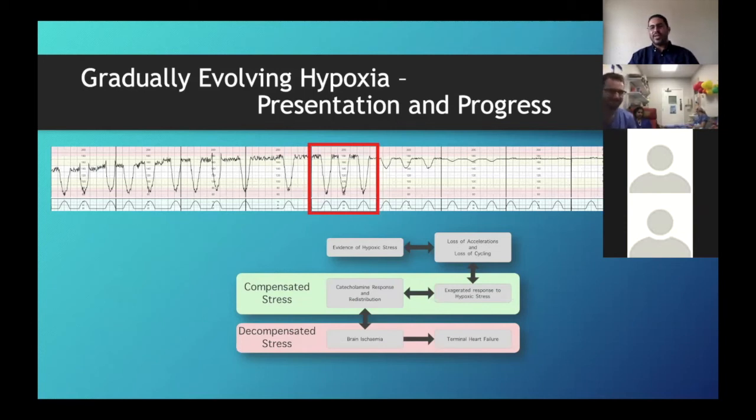You're trying to make STAN not alarm. You don't want to reach the point that STAN is alarming. I think we should all have 2 strikes, and we're not allowed to have STAN events, all right? Each trainee has 2 strikes, and you're not allowed STAN events, right? If you get one valid one, then that's 1 strike. 2 strikes, sorry man, you're back on gynae. Yeah, okay.